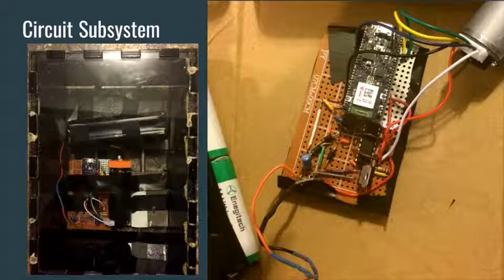So there's also the safety feature of the circuit subsystem. There's a button on top of the Arduino, and there will be a button that leads to the enable line of the H-bridge. When these two buttons are pressed, it actually stops the circuit from working. These buttons would be pressed in emergency circumstances only. So if there was a malfunction of the motor, and the motor would continually turn and not stop and cause discomfort for the patient, they would press these two buttons and stop the whole circuit from working.